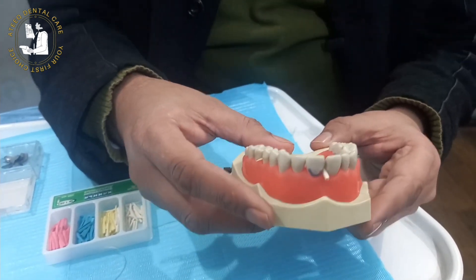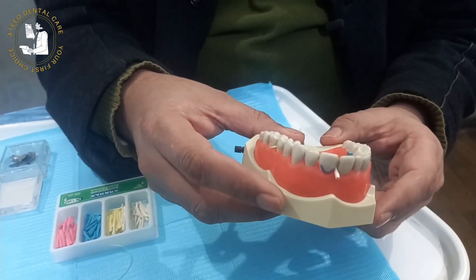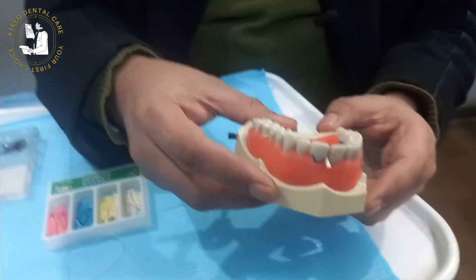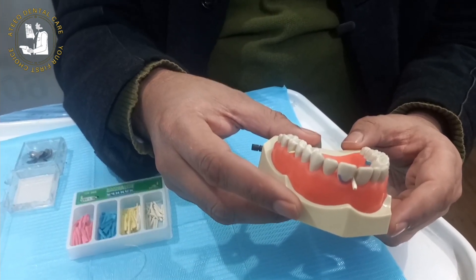So wooden wedges or pre-wedging has three important functions. Number one: achieving tight contact after the restoration. Number two: soft tissue protection. And number three: hard tissue protection, especially of the adjacent tooth.